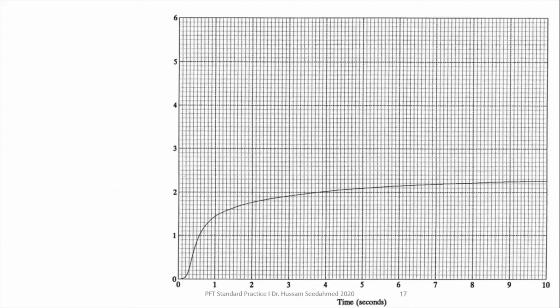Okay, another exercise. Now, can you look at this curve and then measure the FVC, FEV1 and the ratio?